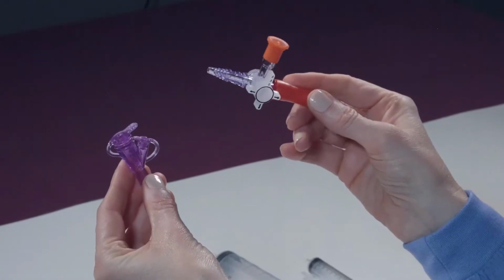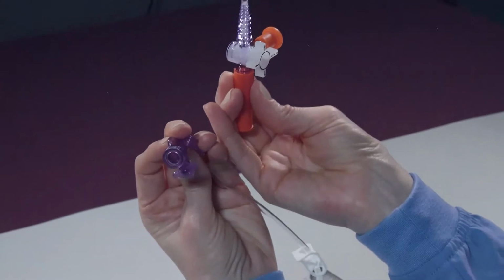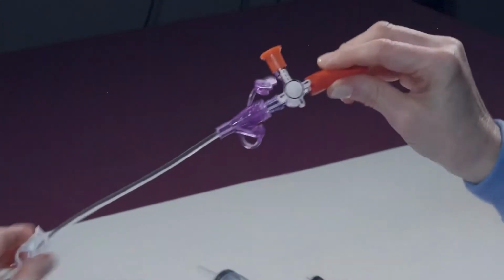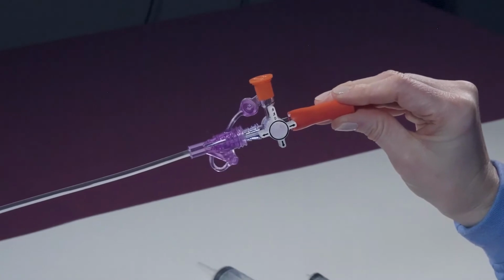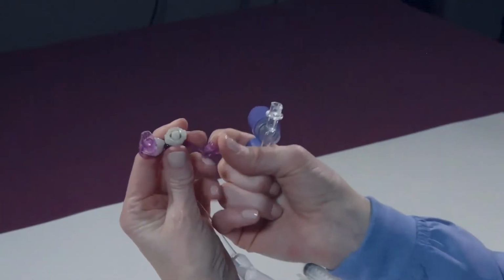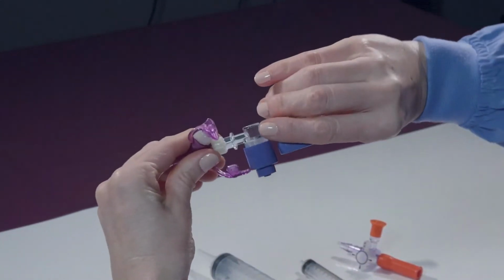The valve adapter for the traditional tube has a cone-shaped attachment that is inserted into the tube. The valve adapter for the ENFit tube has an ENFit attachment that is screwed into the tube like this.